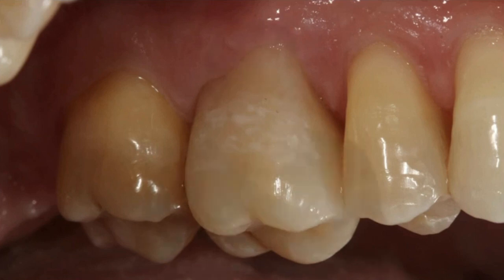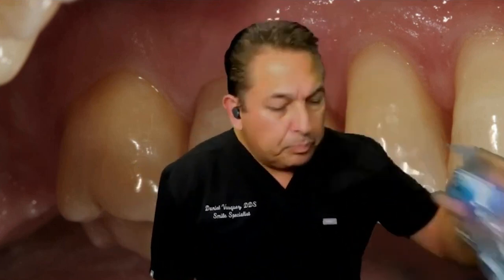People have asked me, Dr. Vasquez, will that crown break? And the answer is no, it's not going to break. It might debond, because the resin, the composite, even though it has ceramic in it, has more elasticity. It can actually come off more easily than a glass ceramic, correct? So it can debond, but how will you avoid the debonds?